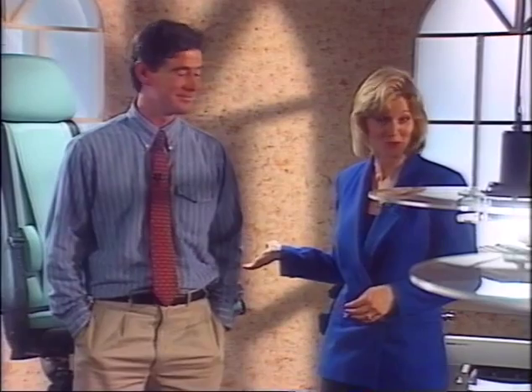Pretty impressive system, wouldn't you agree? Certainly looks easy to use. Having instant access to a normative database will definitely have a positive impact on my practice. With a small facility, the footprint is good for me. I can see that my staff will be up and running on the Windows software in no time. It's great having the entire user manual right on the help screen.